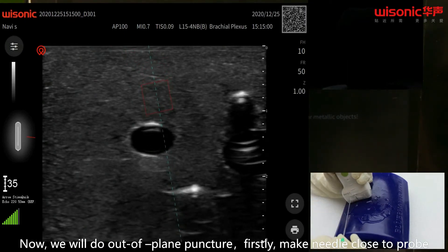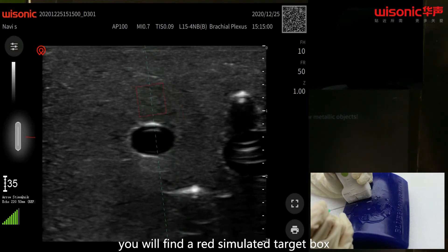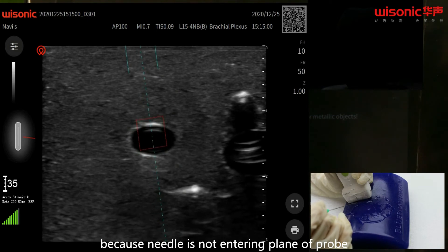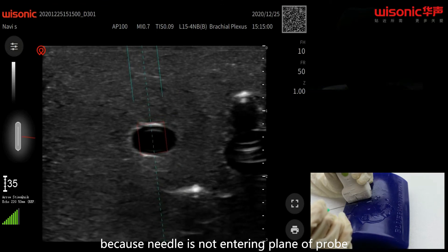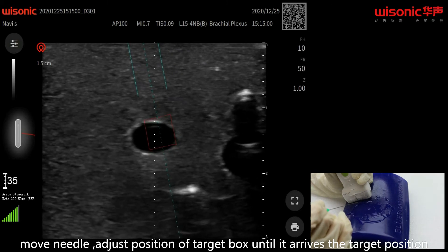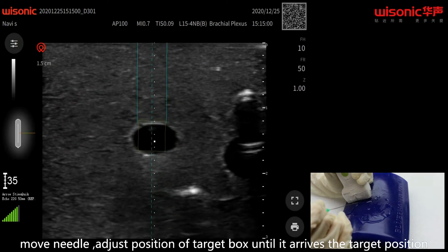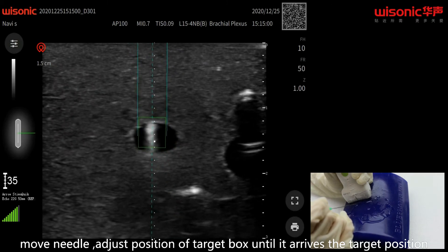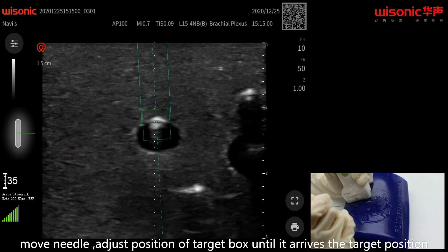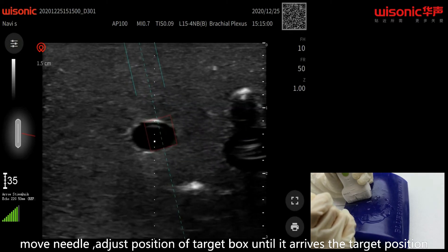Now we will do out-of-plane puncture. Firstly, make the needle close to the probe. You will find a red simulated target box. Because the needle is not entering the plane of the probe, move the needle and adjust the position of the target box until it arrives at the target position.